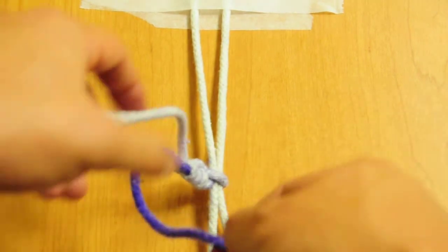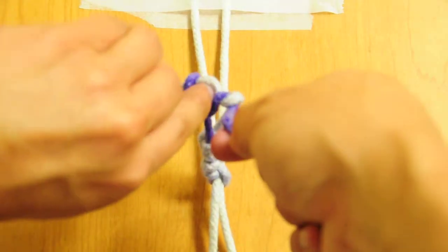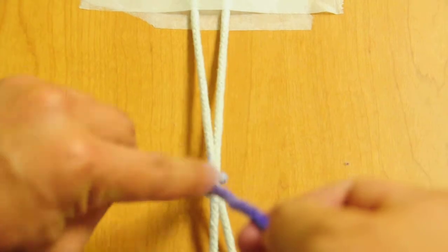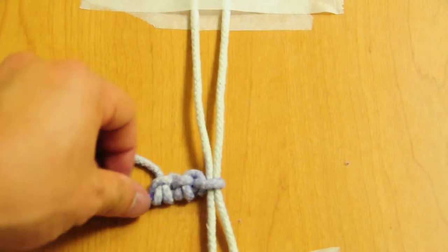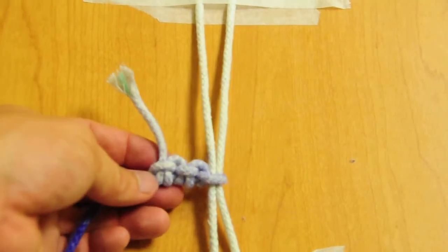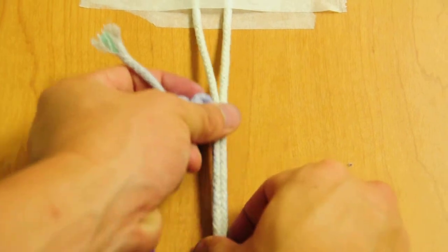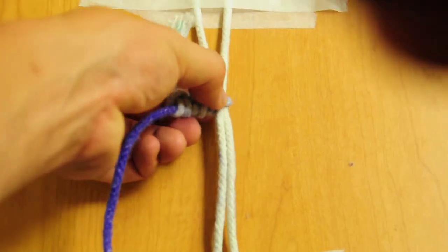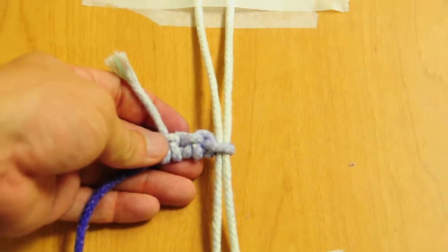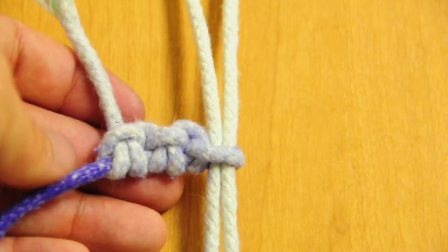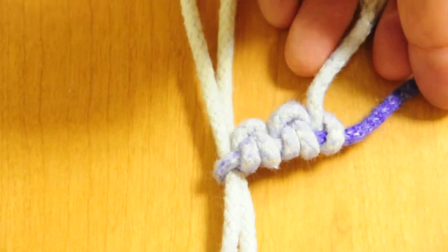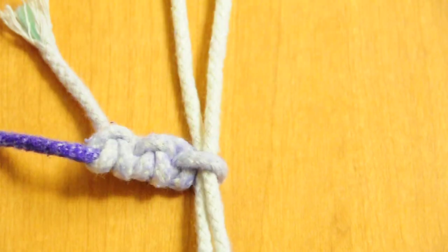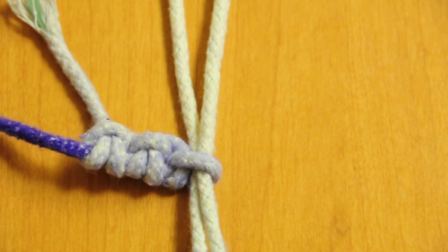I'm running out of suture, but what you'll end up seeing, or what you're actually doing, is laying down knots that look like this. These are half hitches that are back-to-back in reverse direction.